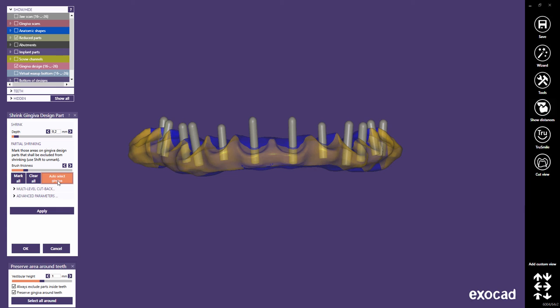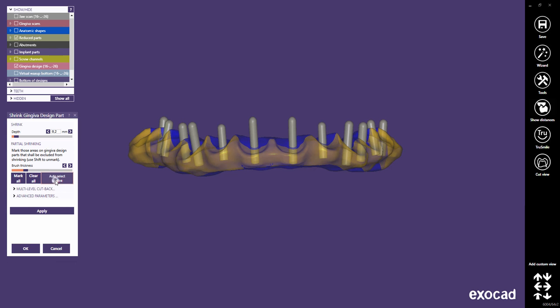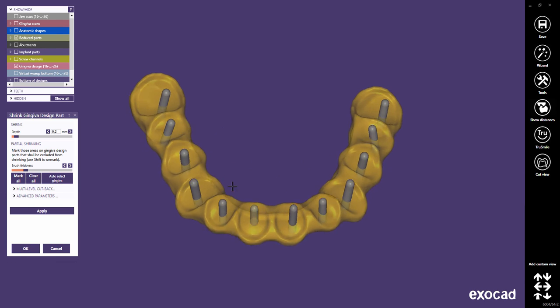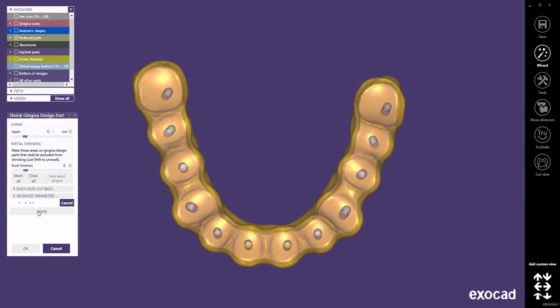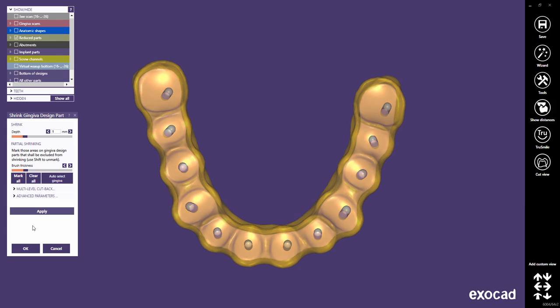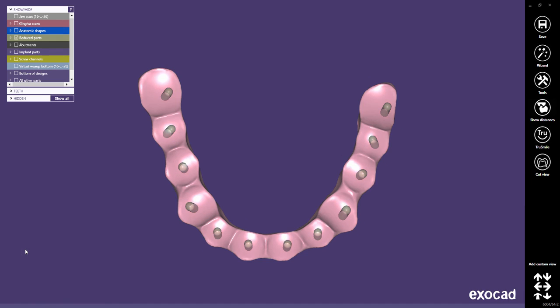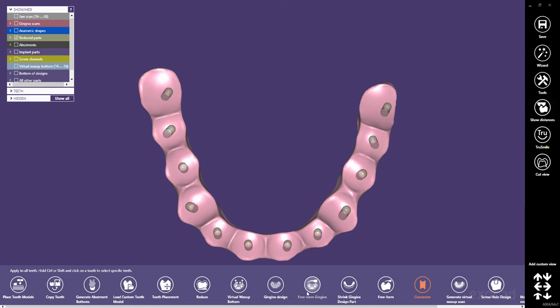To do this, we deactivate the auto-select gingiva, and we clear all blue areas from being excluded from shrinking. Choose a shrinking depth of 1 mm. Click Apply to start shrinking. Click OK to close the Shrink Gingiva Design Part dialog, and choose Freeform Gingiva in the expert mode.